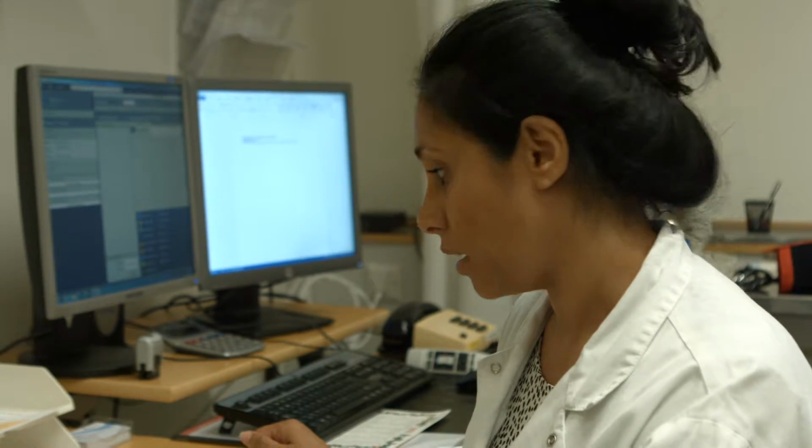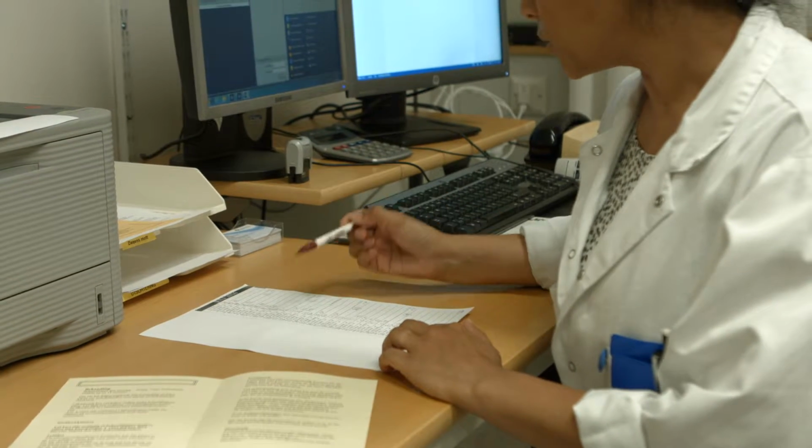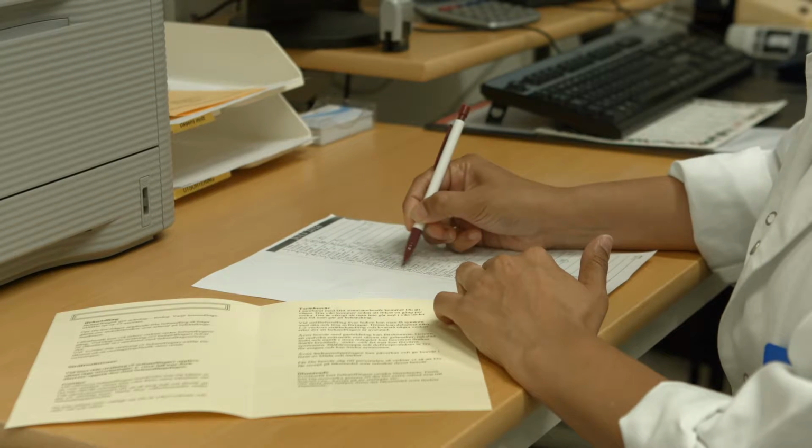During this meeting, your physician will explain to you in detail the purpose of the treatment, possible side effects, treatment options, and any ancillary treatments. You will also be informed about how the treatment will be performed, for example, how many exposures are likely to be needed. In most cases, you will receive irradiation 5 times per week.